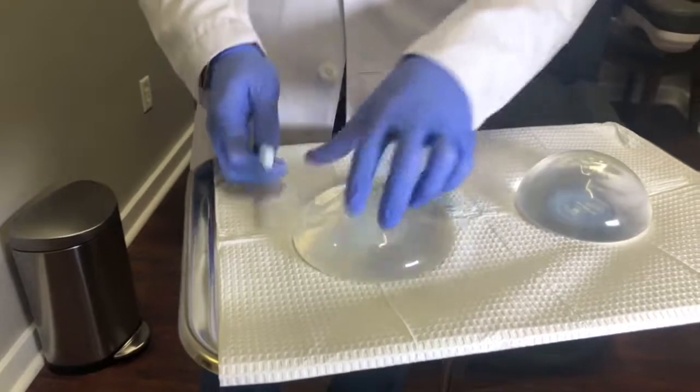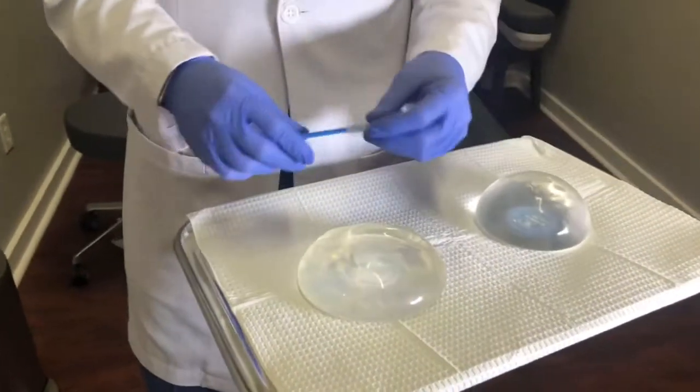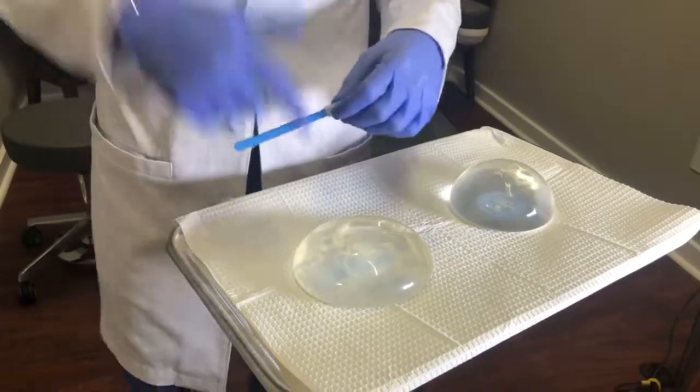This implant here is actually an old McGann implant. McGann was the company that became Allergan, so this implant is actually from the 80s. We're going to start with this one.